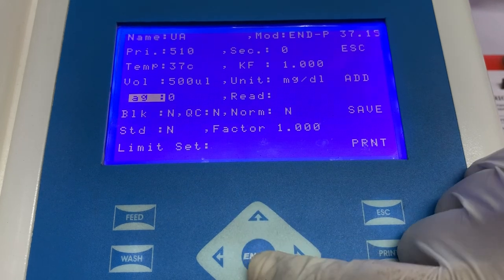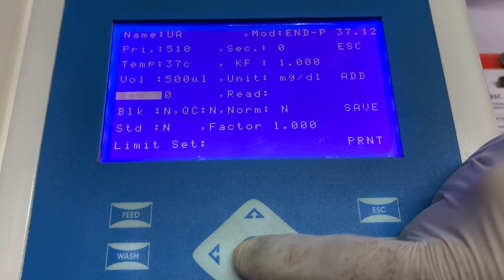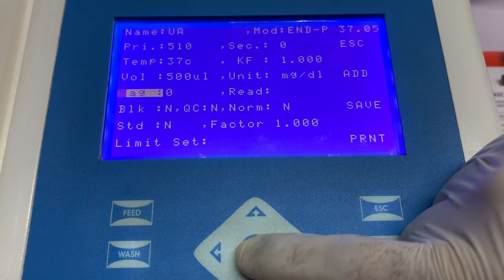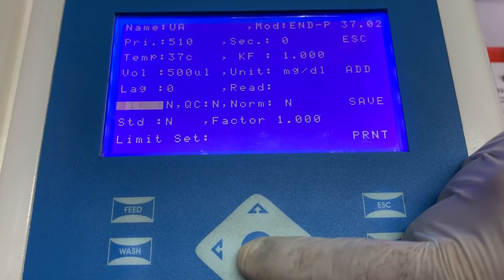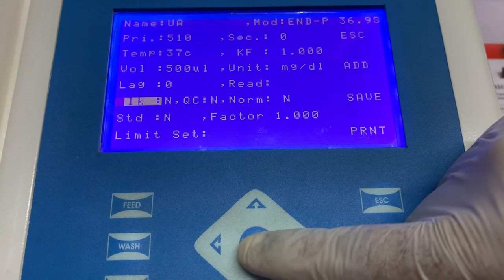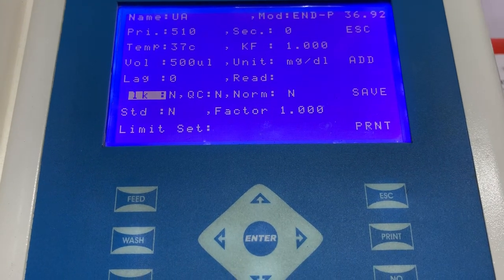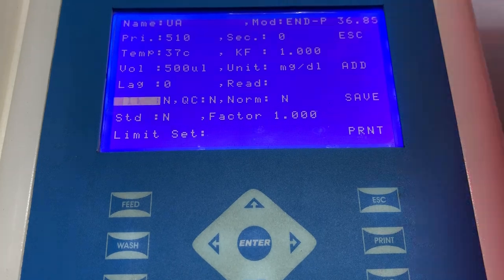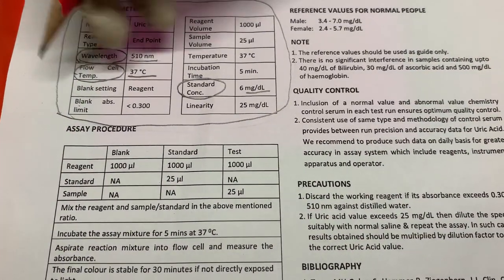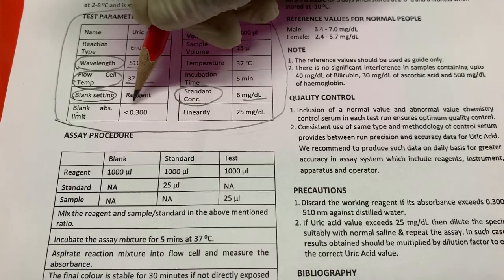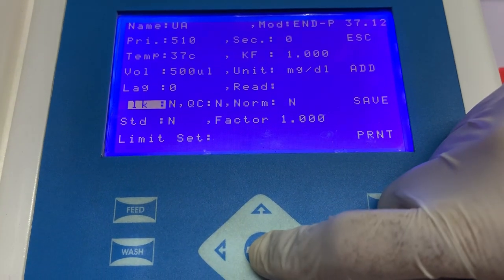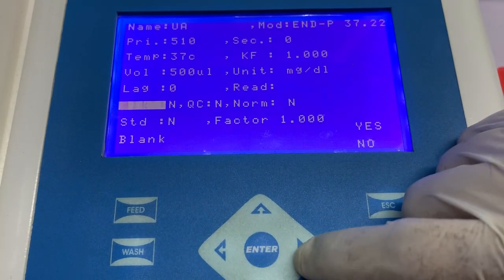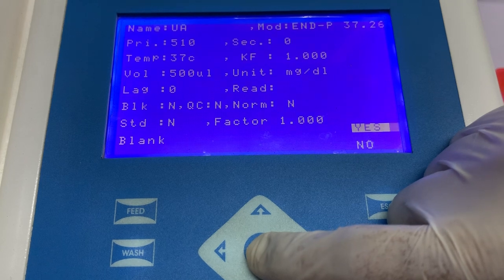Next, we have to enter the information of lag time and read time. Because uric acid is an endpoint parameter, this is to be left blank. Next, we have to enter the information of blank settings — whether reagent or distilled water is to be used for blanking. This information can be seen in the instructions for use, where the manufacturer clearly mentions whether reagent or distilled water is to be used for blanking. In this case, because reagent is to be used for blank, we will select the option of blank and then select yes.